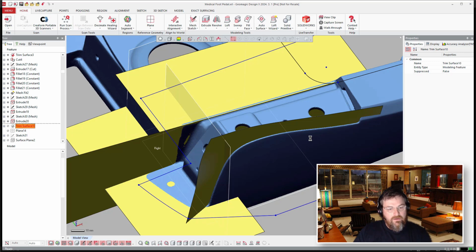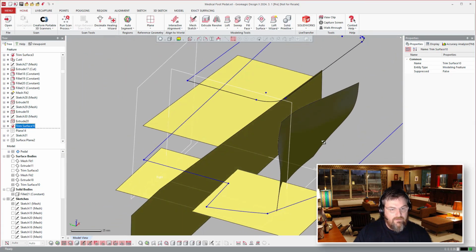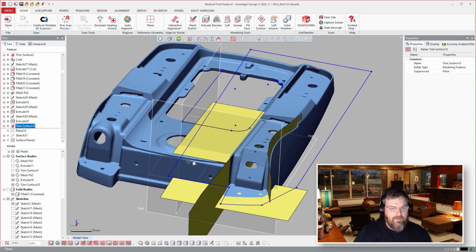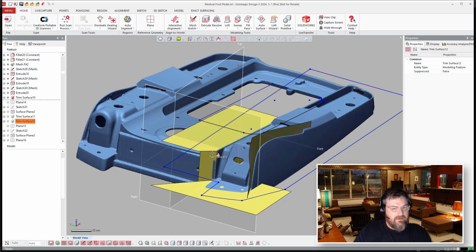And again, this is another one of these techniques where you're going to create a tool in some different stages to then use that tool to cut away from the main body. And this is why I like to call this type of workflow, where we create a positive object and then go ahead and use all these tools to then cut away from it. So you see here that we did some more trims, cutting it back from different directions.